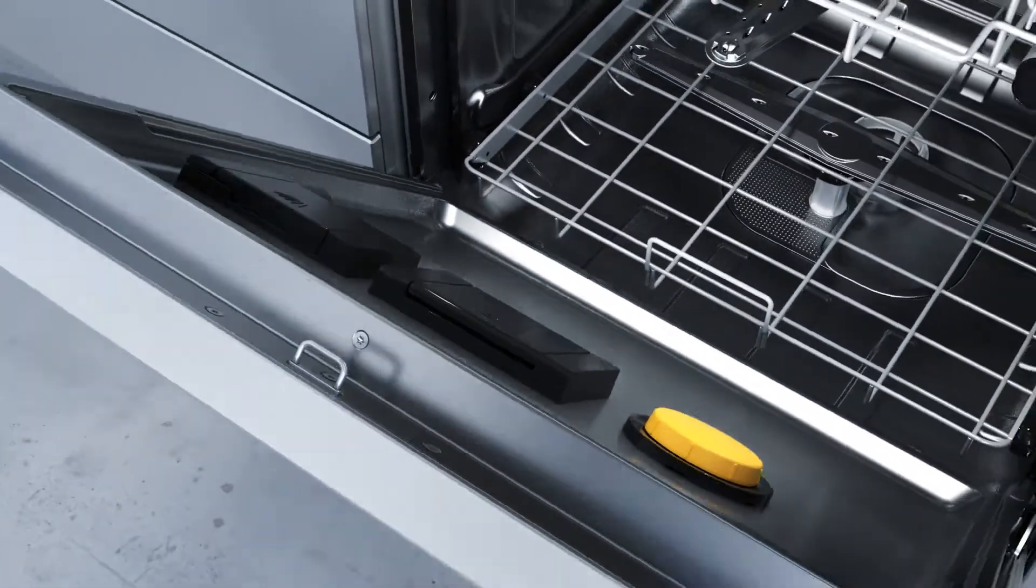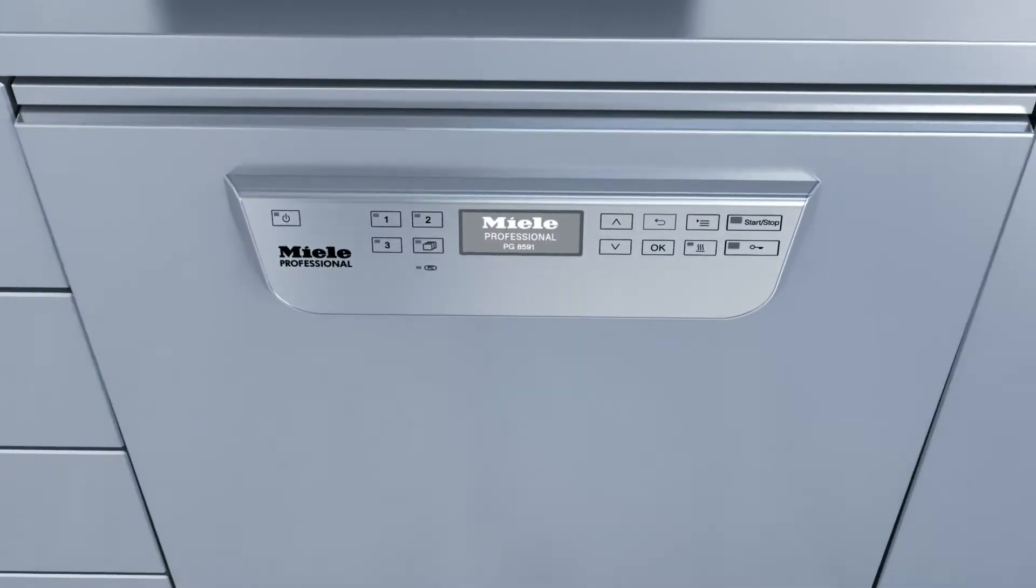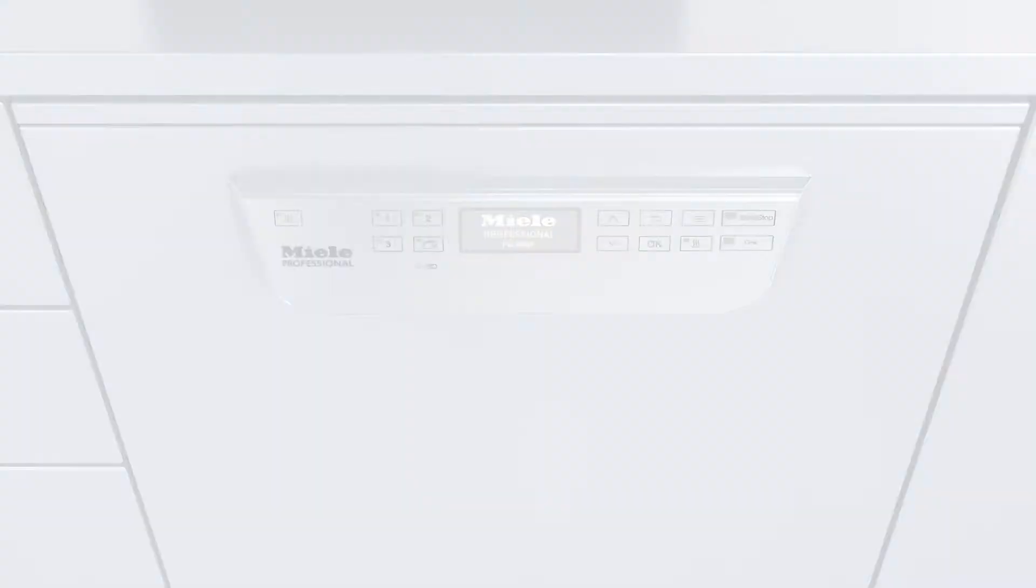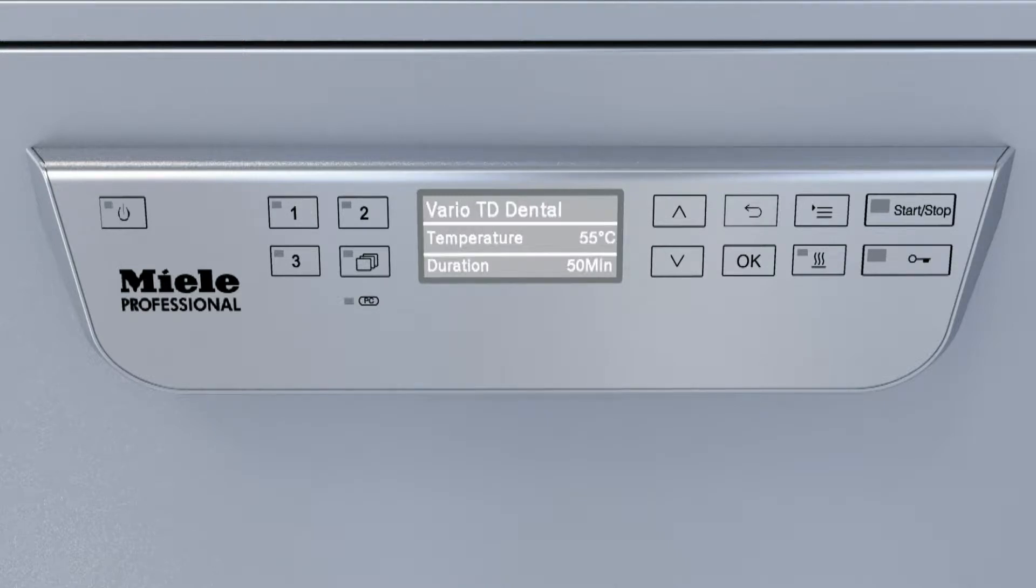The interactive display is simple and intuitive. Frequently used programs can be assigned to direct action push buttons for ease of access.